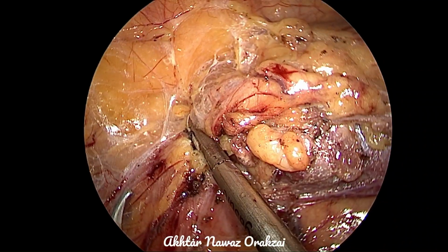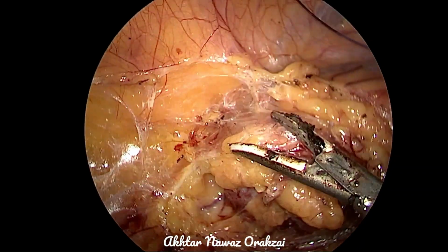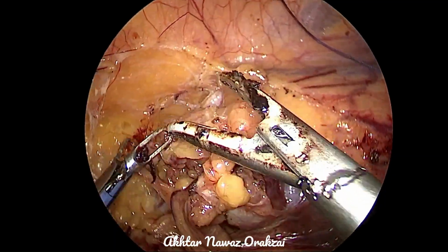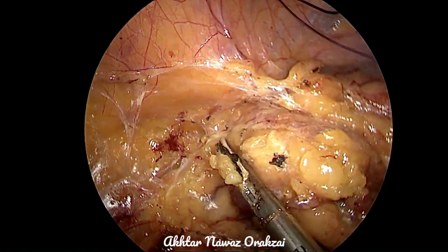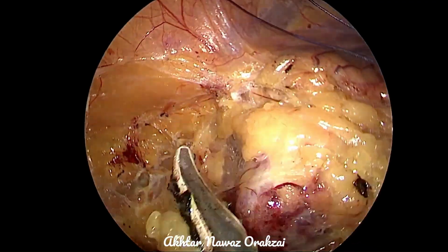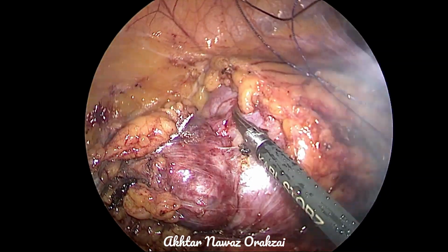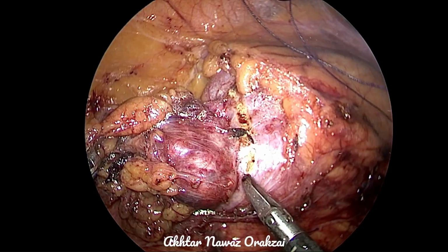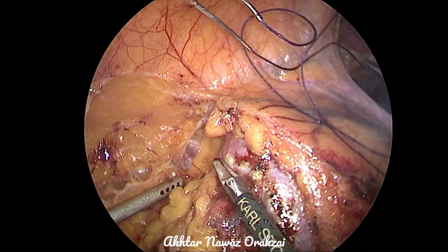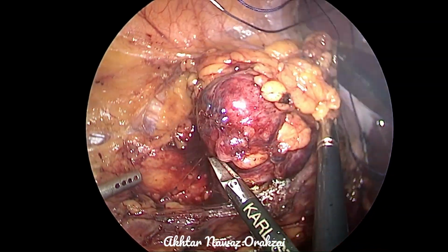The reason number two is, as we cannot grab and pull the tumor directly for the risk of rupture, we can very easily grab this fat and play around with the tumor easily. So these are the two reasons, and it will be obvious once we start dissecting, because we all know that dissection is all about traction and retraction. So we draw a line of cleavage on the normal renal parenchyma around the tumor, just to know that we will be cutting this area.